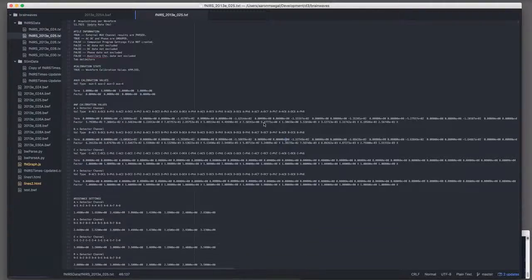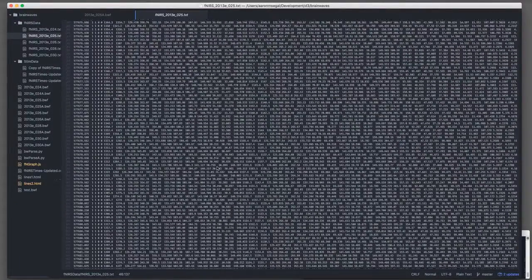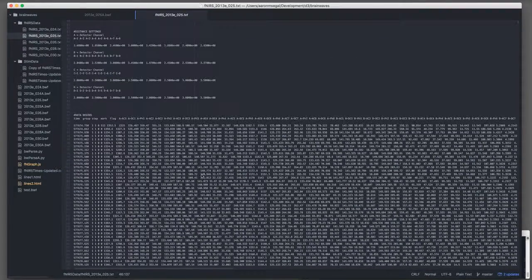So one thing is that you can see up here it has a big header area and then it hits the actual data of the scanning. And another thing is that a lot of these data points aren't actually useful as far as visualizing the data.